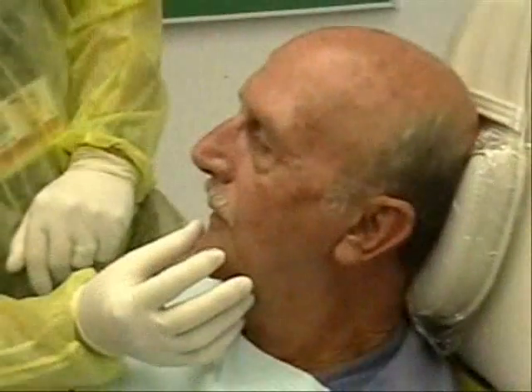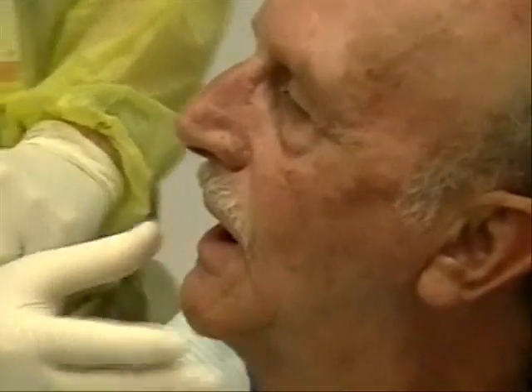What do you think, Jeff? Cupid's bow. I don't know if he can afford to roll it out a little bit more by bringing the occlusion rim forward or not. Do you want to put some wax on it? Fifty-five. That's pretty good.